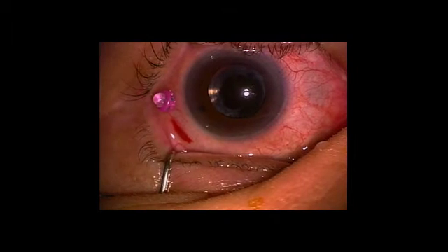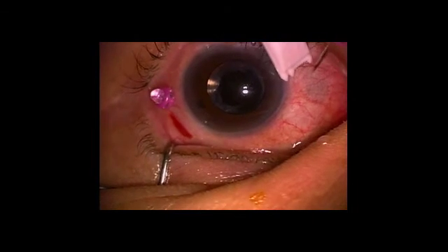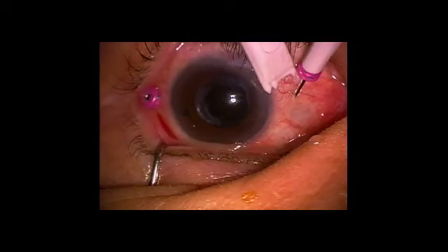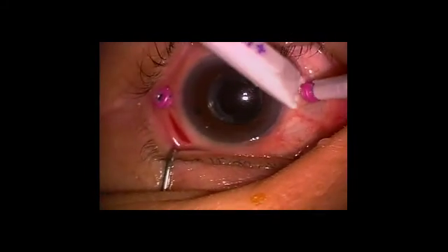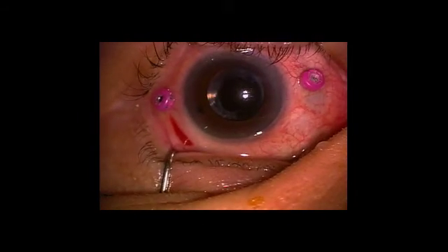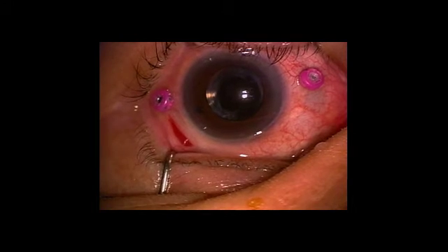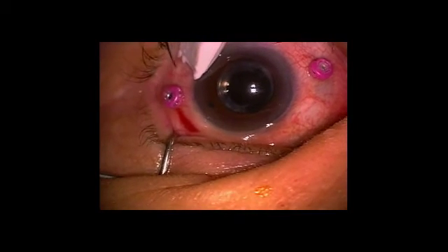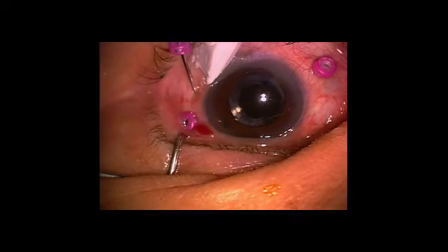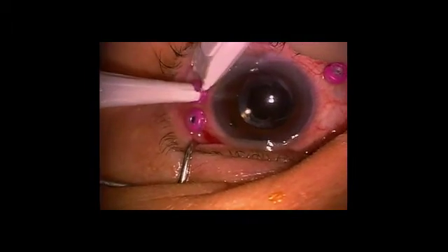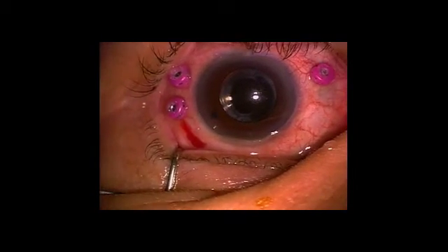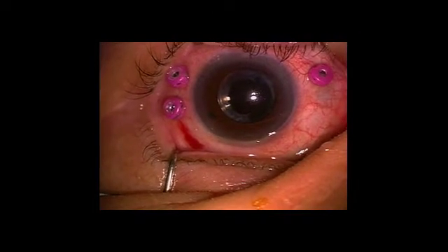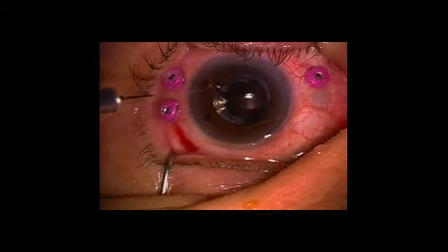As you may notice, the trocars, or those pink hubs, are actually pink, versus with 25-gauge vitrectomy systems, the trocars are blue. So it's an easy way to tell which is which. There's a slight difference with 27-gauge trocars in that they have one-way valves. That is, they don't let any fluid out of the eye.